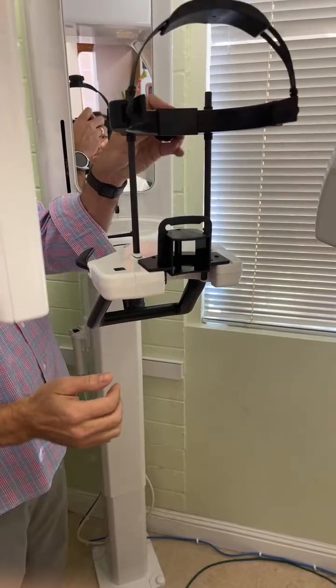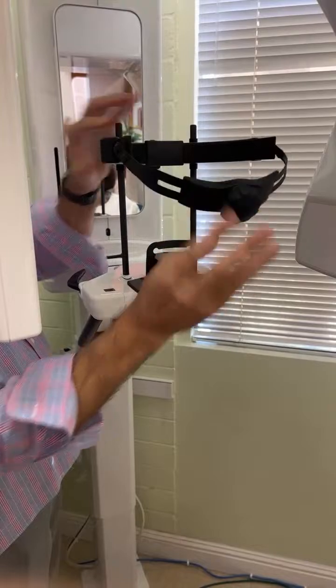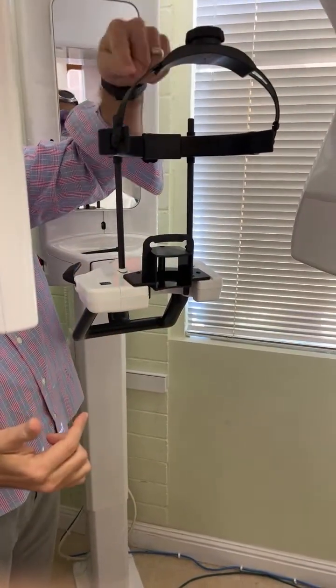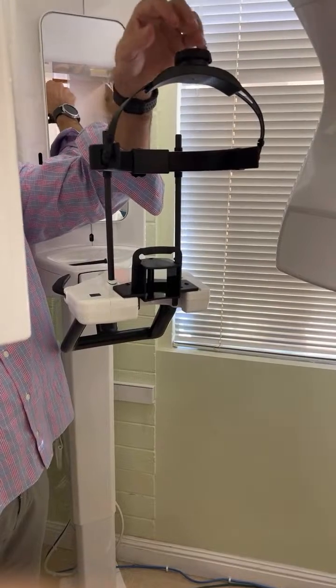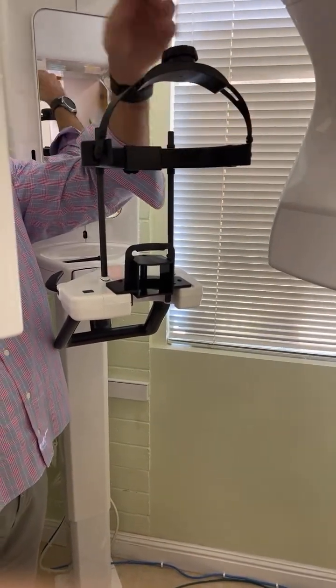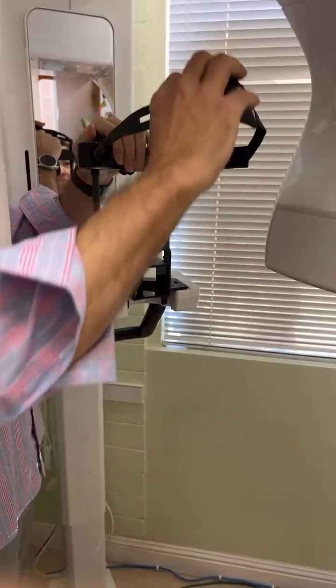This temporal should be open. And this shouldn't be like this. It should be all the way up out of the way. You don't need to use this for 2D images. You use this primarily for 3D with high resolution scans because they're going to be in the machine longer. And there's a tendency for them to shake or move more because they're in the machine longer. So I would use this on a high res.